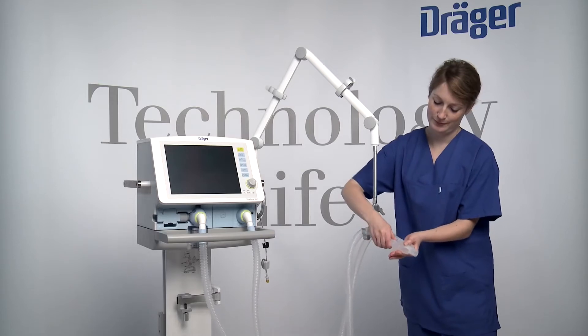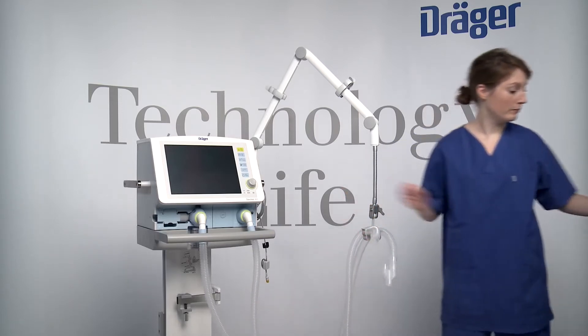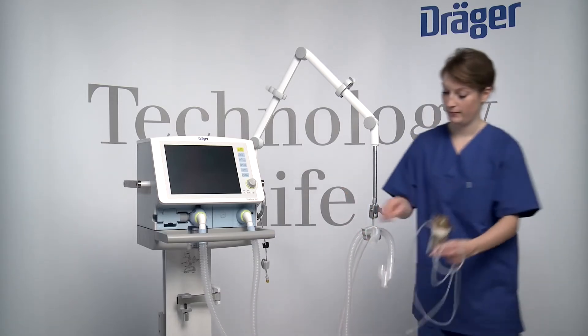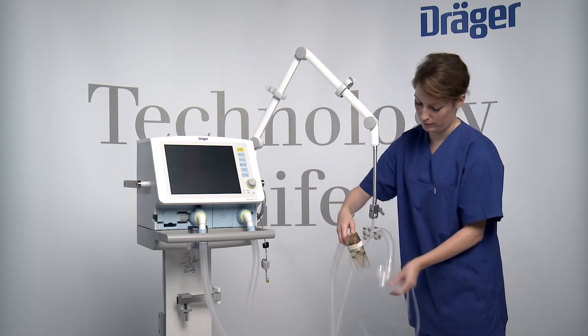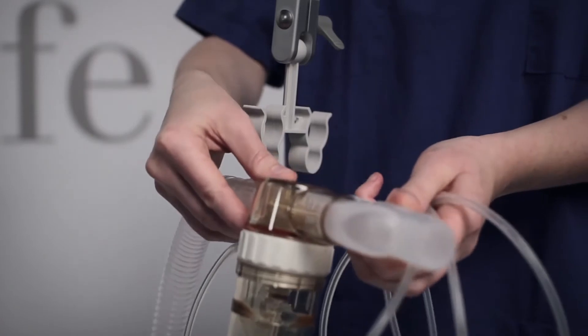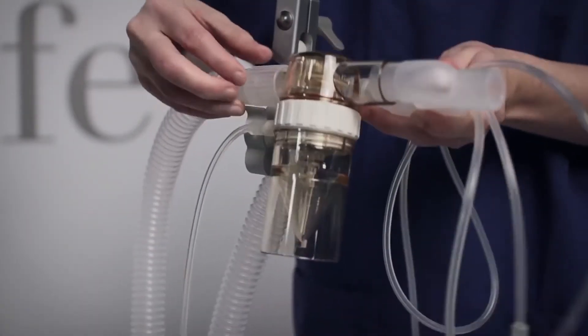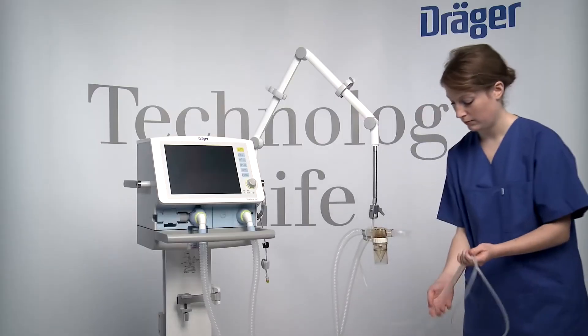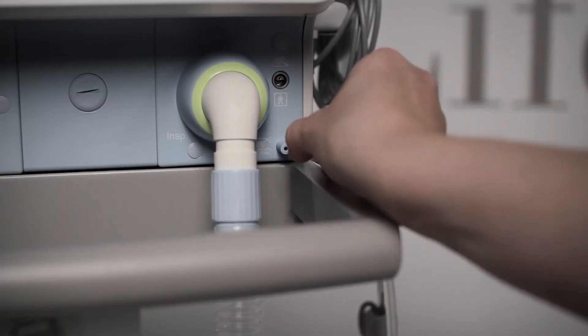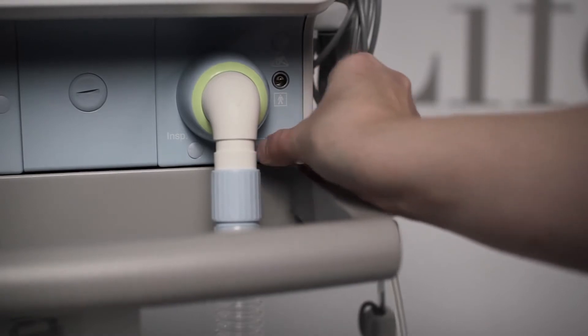If a pneumatic nebulizer is used, connect the nebulizer to the inspiratory side of the Y-piece and connect the inspiratory hose to the nebulizer. Place the nebulizer in the vertical position. Run the nebulizer hose back to Savina 300 along the inspiratory hose and fit it onto the nebulizer port.